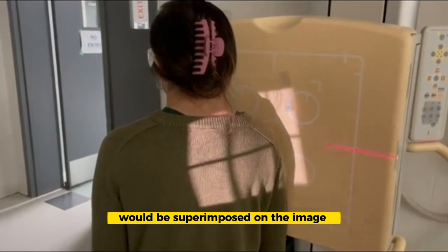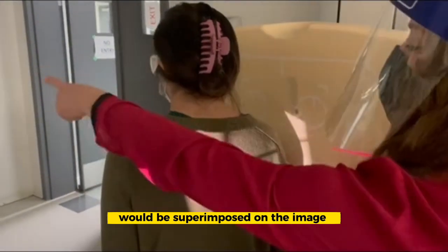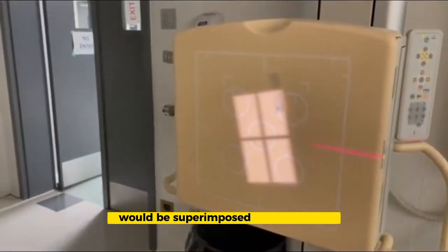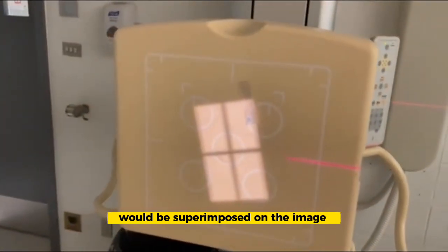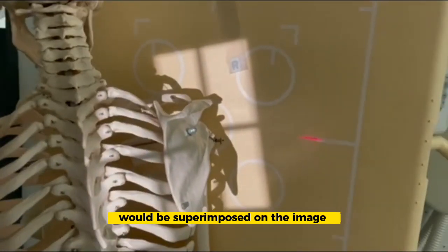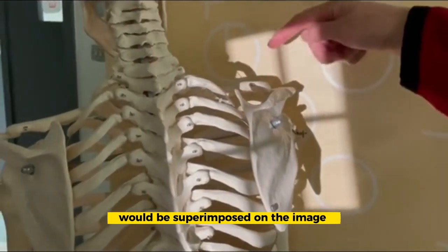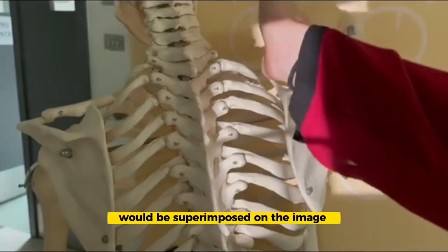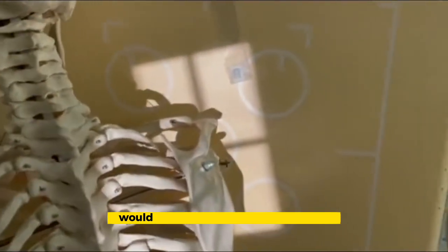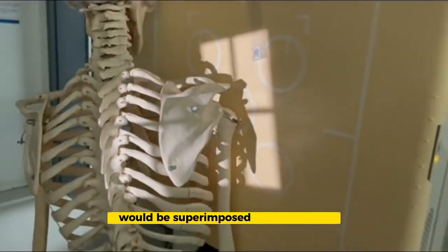On the surface of the patient, the collimation may appear quite large, but if the patient steps away, you can see it is much smaller on the detector. This is due to the distortion of light that occurs when the patient is obliqued. The medial border of the scapula is where you want the central crosshair, and the superior angle of the scapula to the acromial tip should be perpendicular. With correct positioning, the medial and lateral borders would be superimposed on the image.